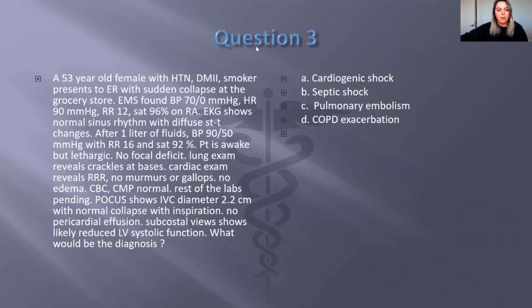Thank you. I have one more question. Which POCUS device are you using at your institution? So we have two. One is in our cath lab, which is a Sonosite, and the one we have in our ICU is mainly the Butterfly. In the low resource setting, is it ever possible to use curved array, or is it too dangerous? I don't think it's dangerous. You can still use it.